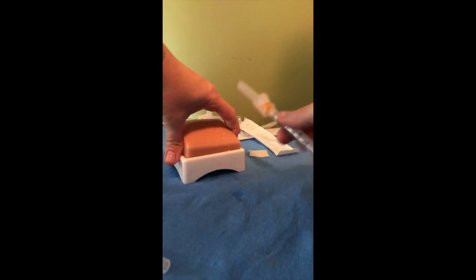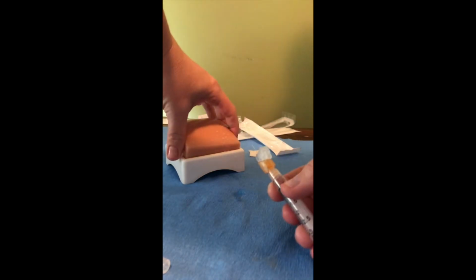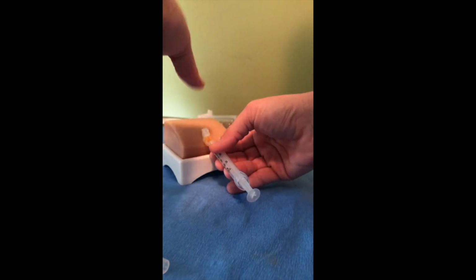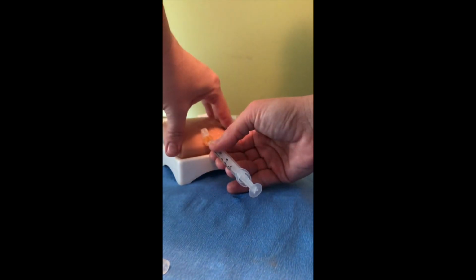Okay, so this one we're going to go at a little differently because we're going to have to pinch skin. And this one's going at a 45-degree angle. Look at the difference in the length of that. So 45 degrees. We're going to go up all the way. You're going to let go, pull back, and then inject your medicine in. Pinch and pull back out. And then safety.